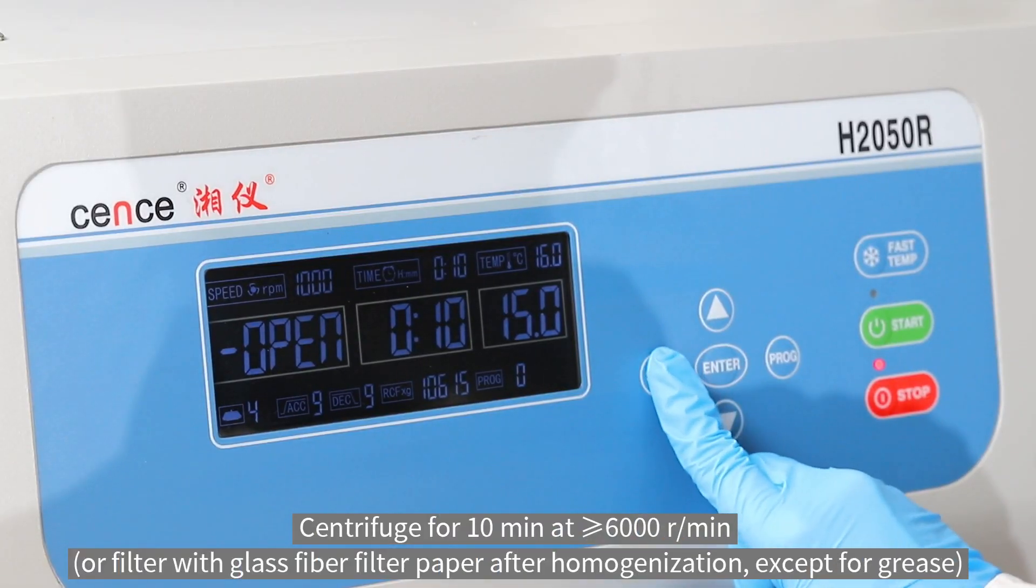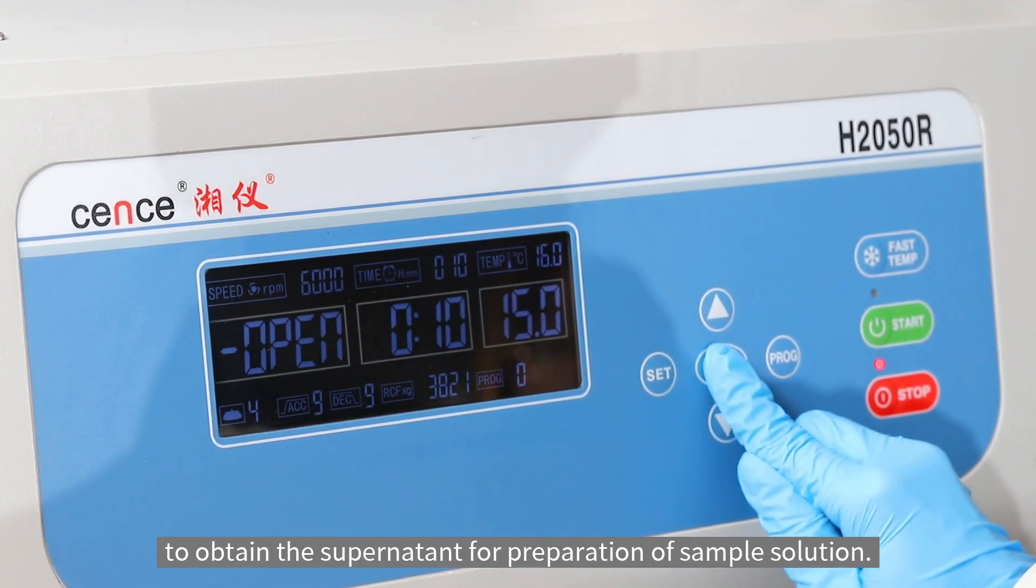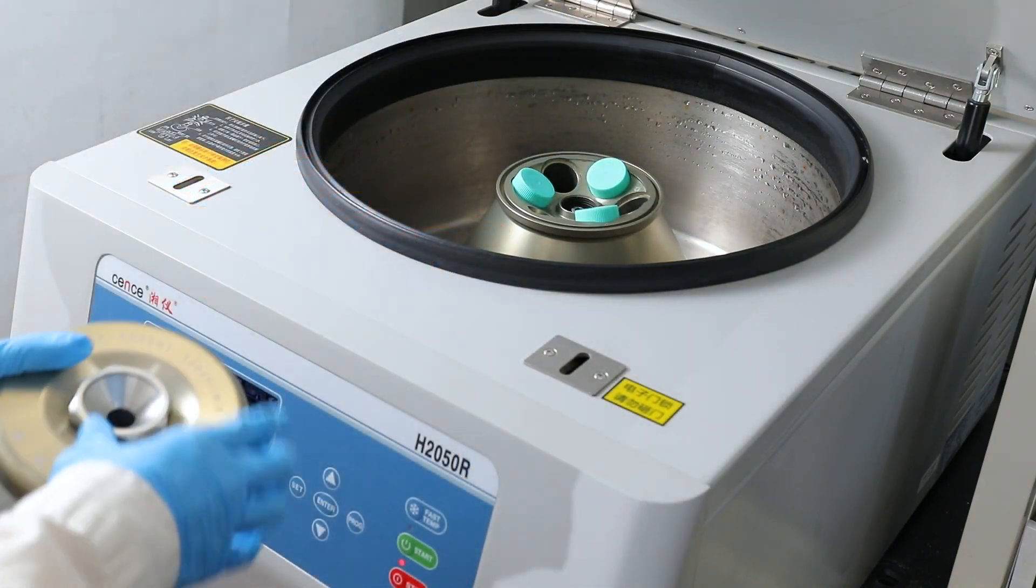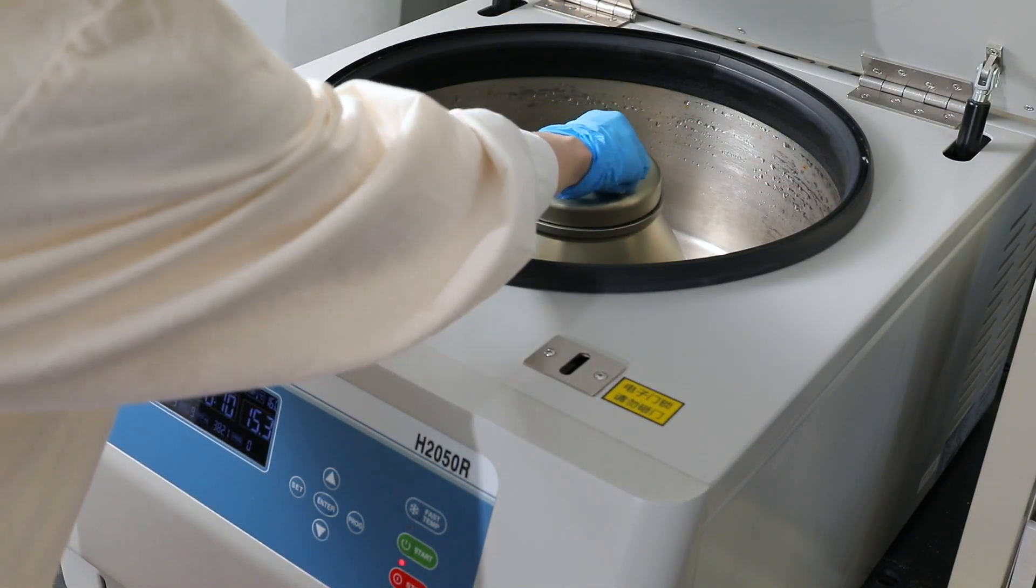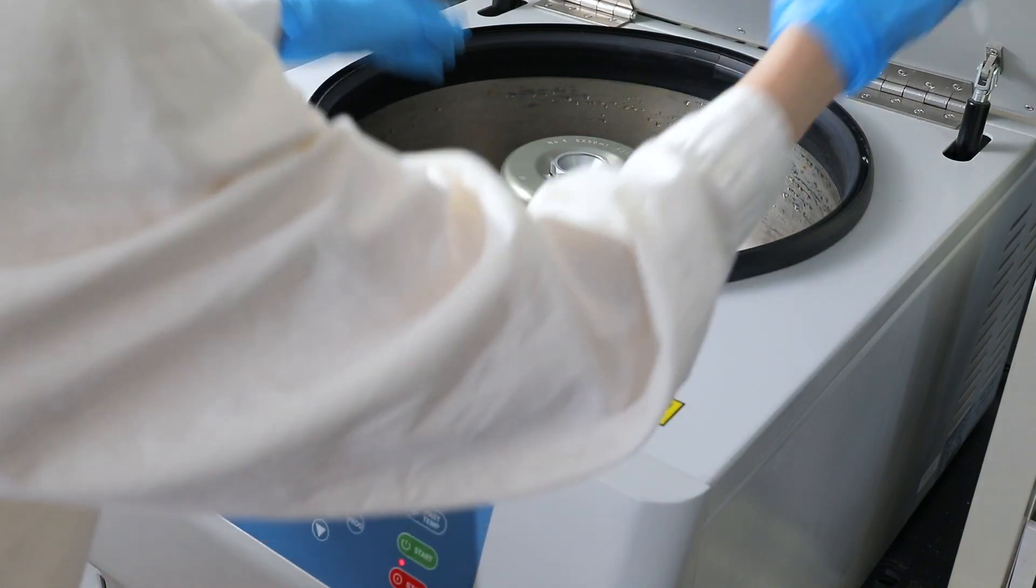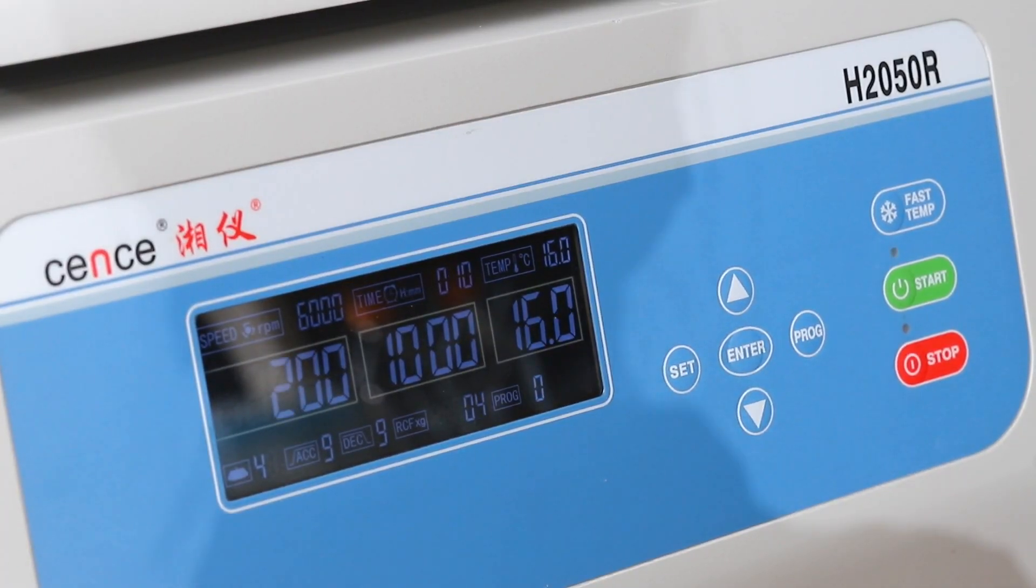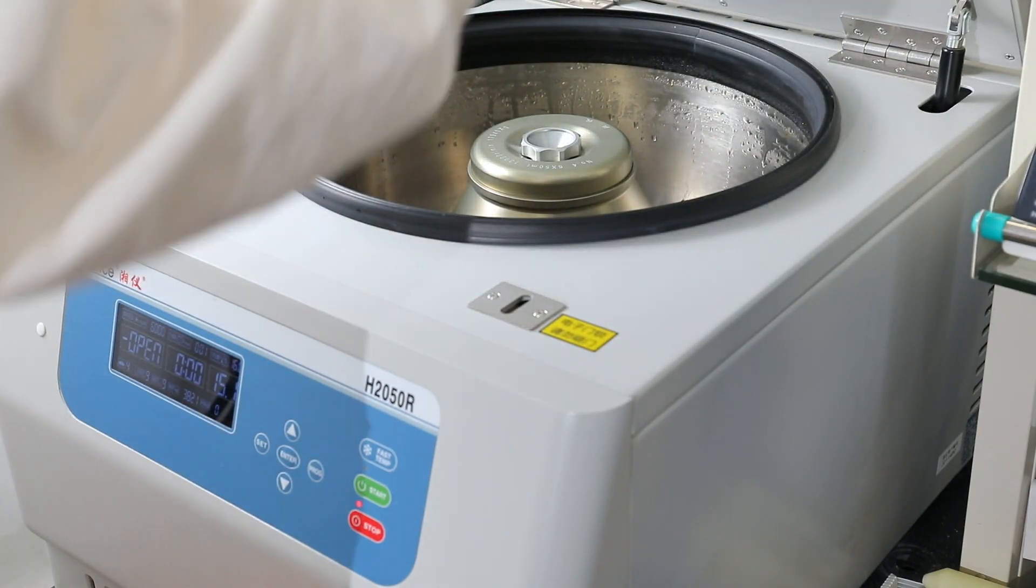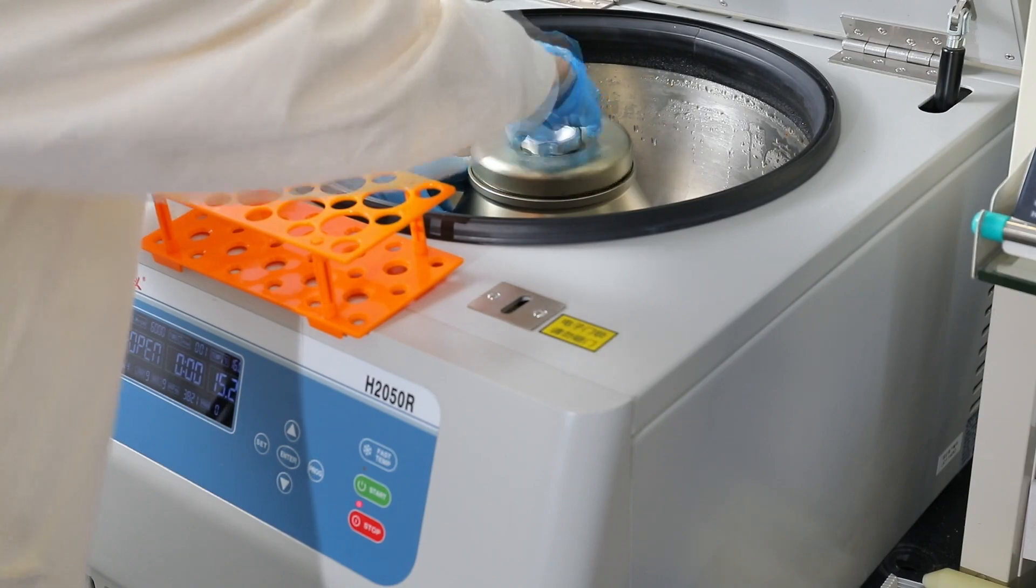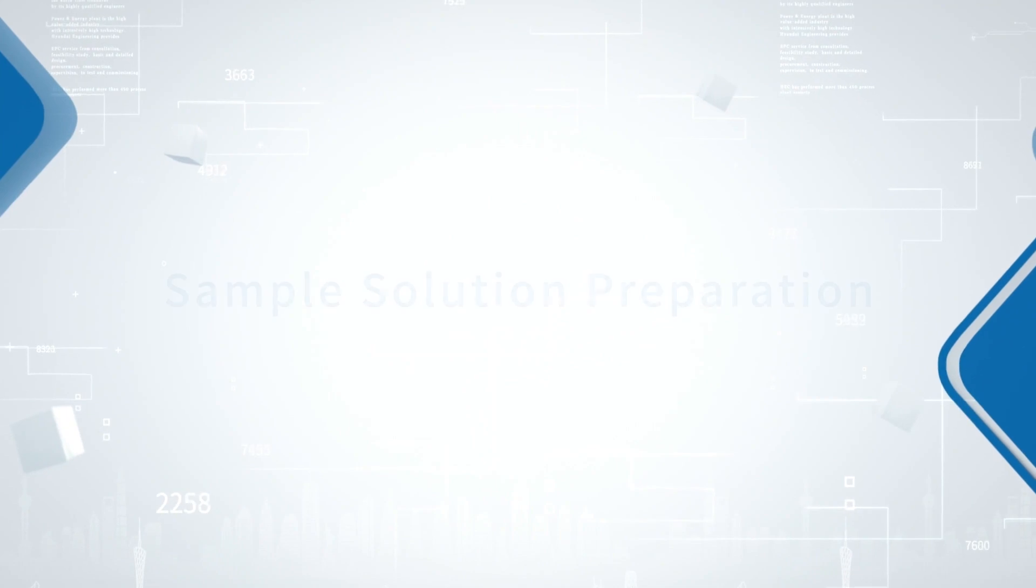Centrifuge for 10 minutes at 6000 rpm to obtain the supernatant for preparation of sample solution.